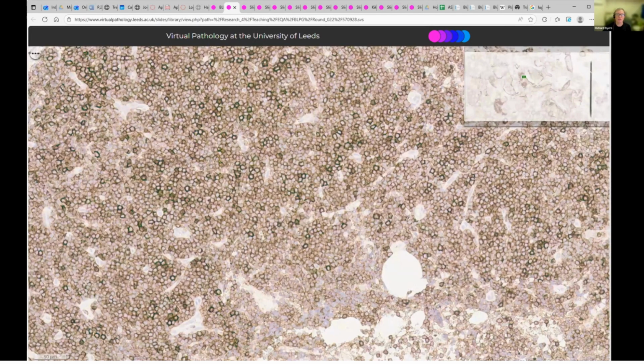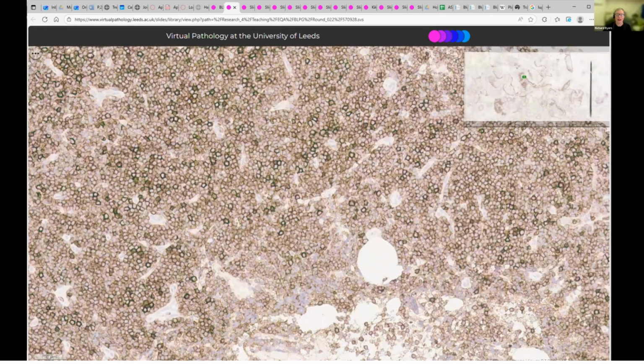So if you look, for instance, here, that very dark cell there is probably a T cell, and that one there, and that one there. And these weaker ones, including these, and these, are the CLL cells. So imagine if all of them are like this kind of paleness, then if you look at low power, it can look negative.